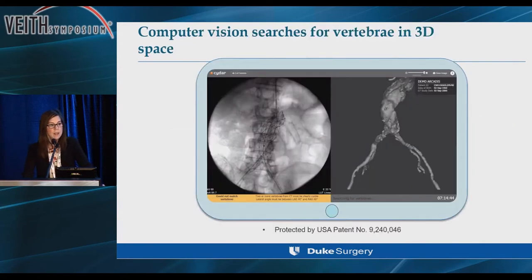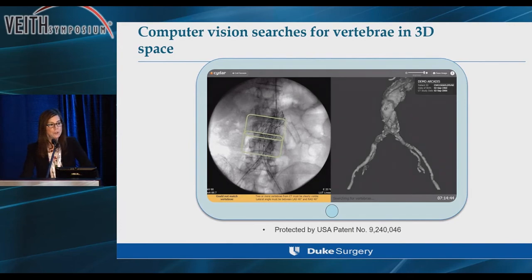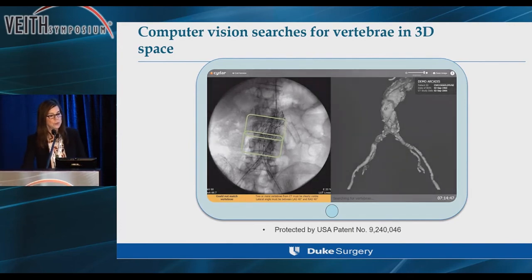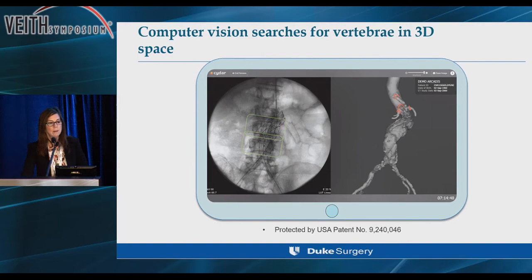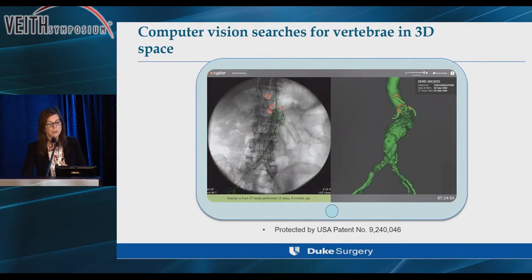As I mentioned, this is cloud-based, so rather than using a mechanical source such as a table for the registration, the technology searches for vertebral bodies and registers the anatomy that way, so it's much more accurate.